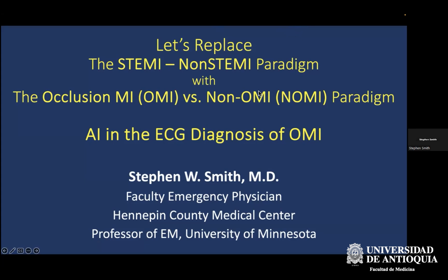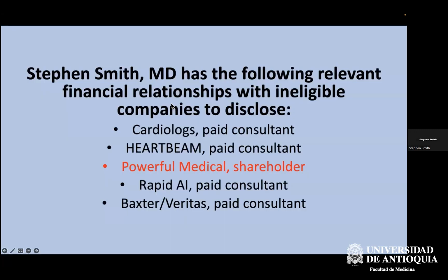Thank you very much. So the title of today's talk is Let's Replace the STEMI Non-STEMI Paradigm with the Occlusion MI, OMI, versus Non-OMI, NOMI paradigm, and also artificial intelligence in the ECG diagnosis of OMI. Okay. So I have some financial relationships, and especially important is that I am a shareholder of Powerful Medical, which makes the artificial intelligence software, which I'm going to demonstrate here.